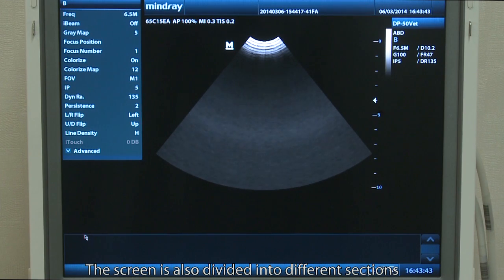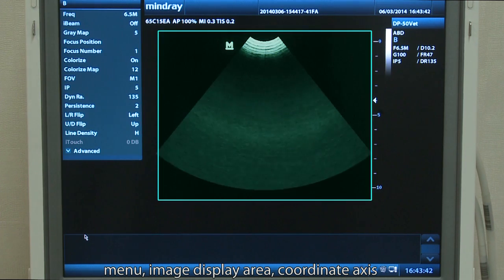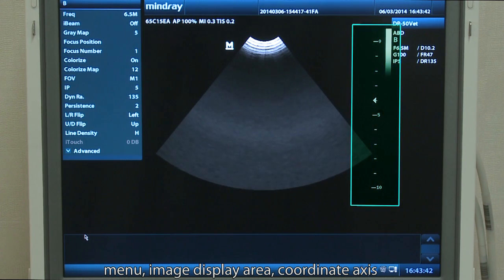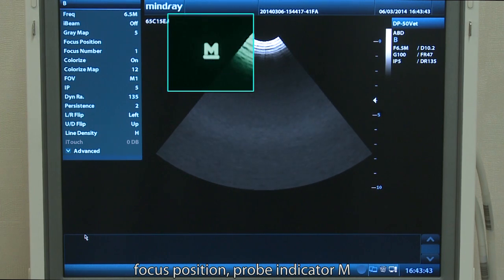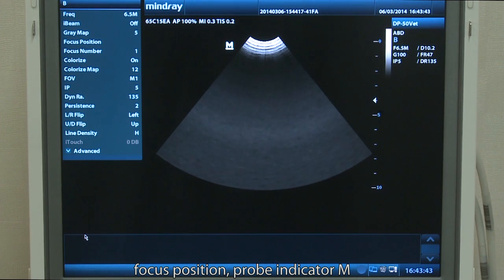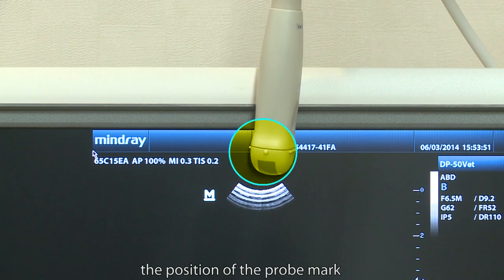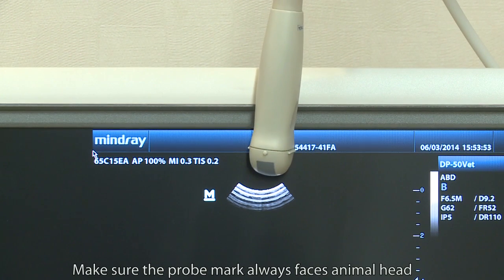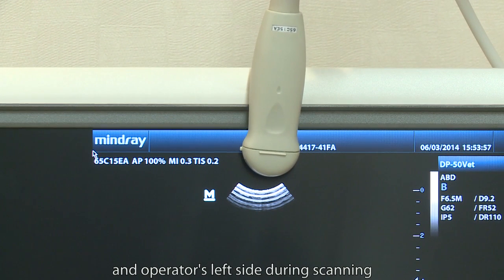The screen is also divided into different sections: menu, image display area, coordinate axis, focus position, and probe indicator M. The probe indicator M corresponds to the position of the probe mark. Make sure the probe mark always faces the animal's head and the operator's left side.